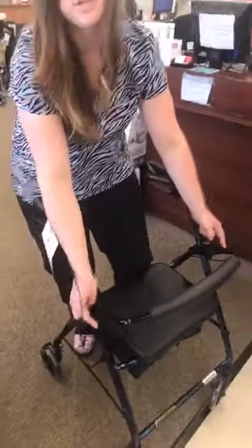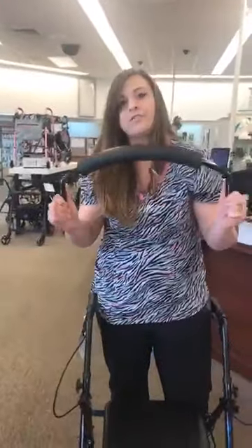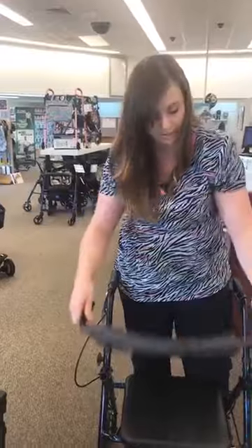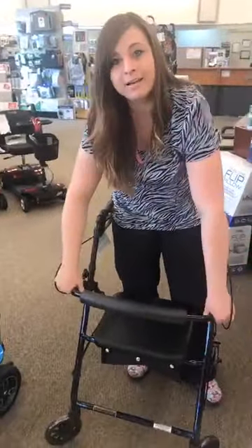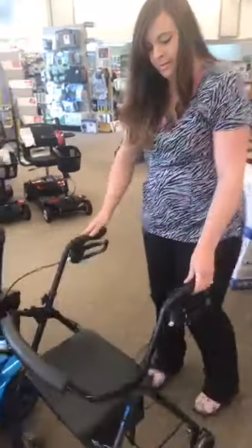Most of them will have little push buttons on both sides of them. You have to push them at the same time, push in on them, and then you pull out. And then your backrest comes off. And again, this is just for storage. Please remember to put it back on before you guys actually use the rollator. And to put it back on, you're just going to line up the holes, push your buttons back in, and then slide it back in. And then your backrest is back on. So that's just general tips and rules over the rollators.